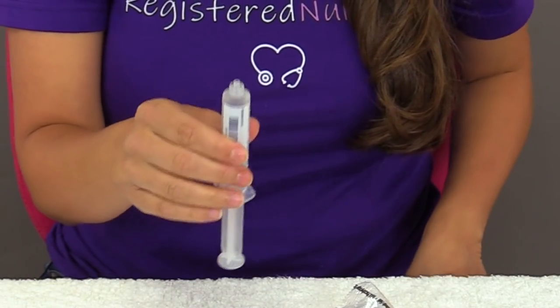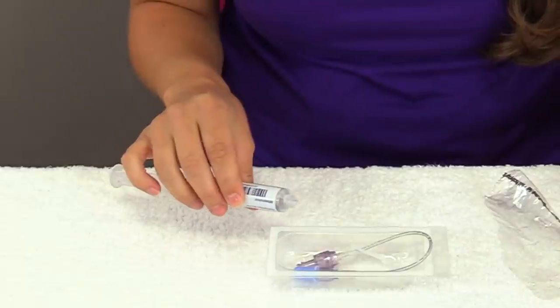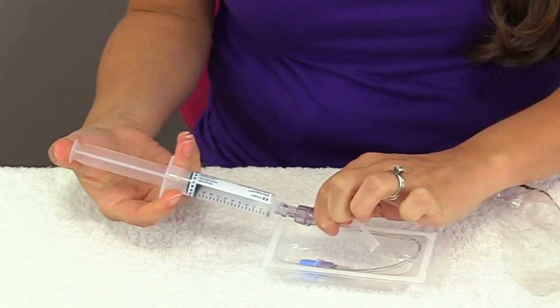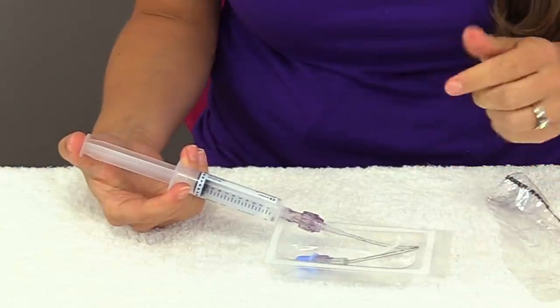Then I'm going to take this flush and twist it onto the cap of my extension tubing — take it here and twist it on.